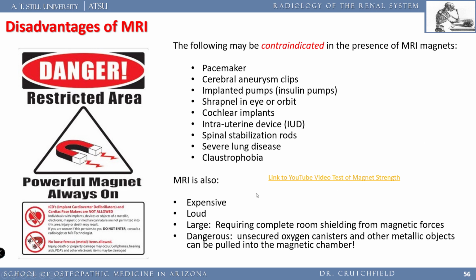Okay. The other thing is they're loud. You'll hear this banging, bang, bang, bang, all the time as it's taking pictures, as the magnets are rotating around you. And if you want to see how strong the magnet is, click on this link here, and it shows how fast it pulls an oxygen tube into the scanner.